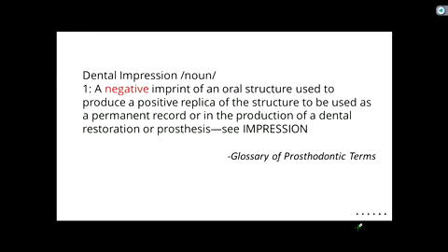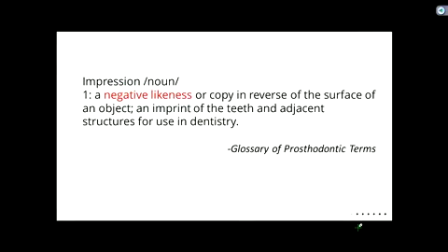A dental impression is a negative imprint of an oral structure used to produce a positive replica of the structure, to be used as a permanent record or in the production of a dental restoration or prosthesis. If we want to get down to the next level, an impression is a negative likeness or copy in reverse of the surface of an object, an imprint of the teeth and adjacent structures for use in dentistry.